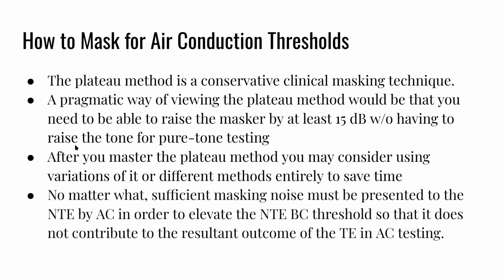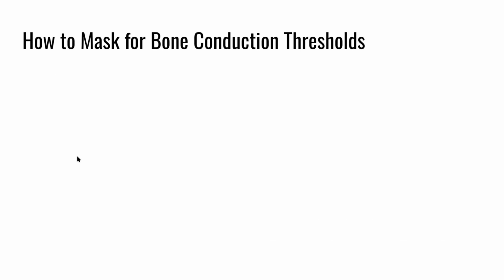No matter what, sufficient masking noise must be presented to the non-test ear by air conduction in order to elevate the non-test ear's bone conduction threshold so that it does not contribute to the resultant outcome of the test ear in air conduction testing.